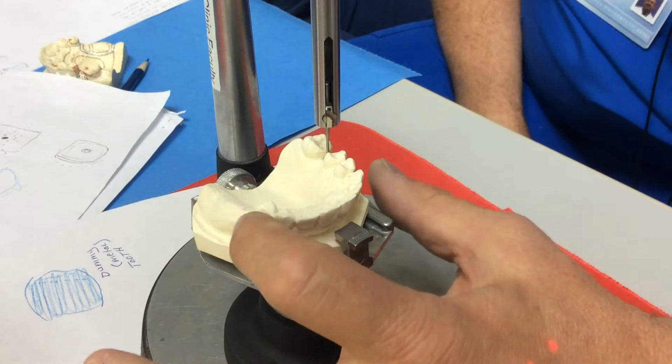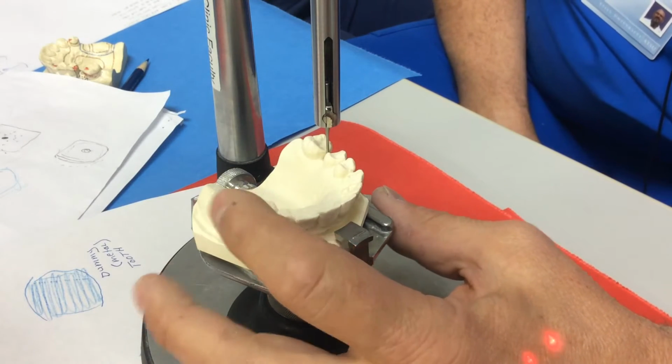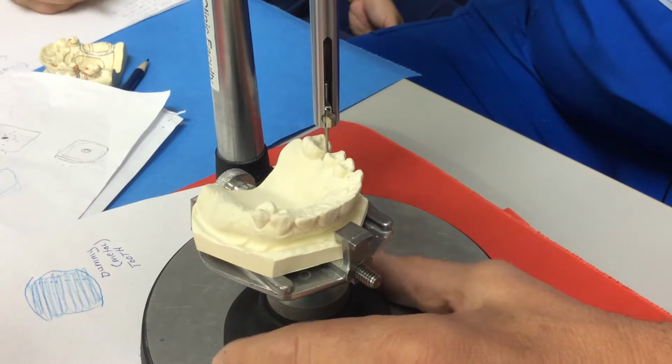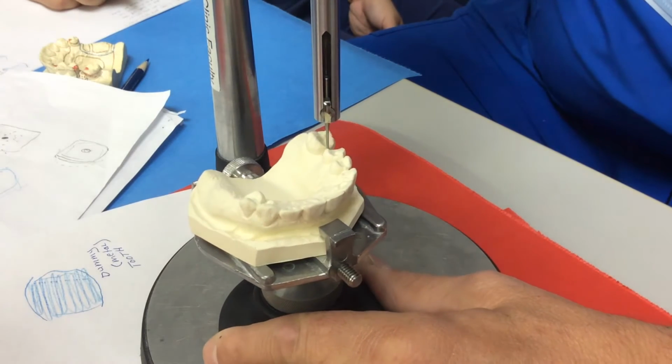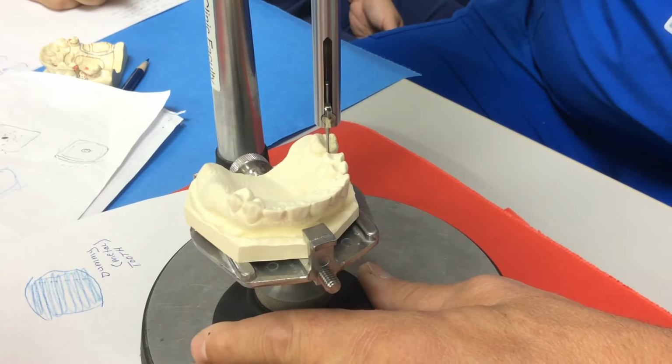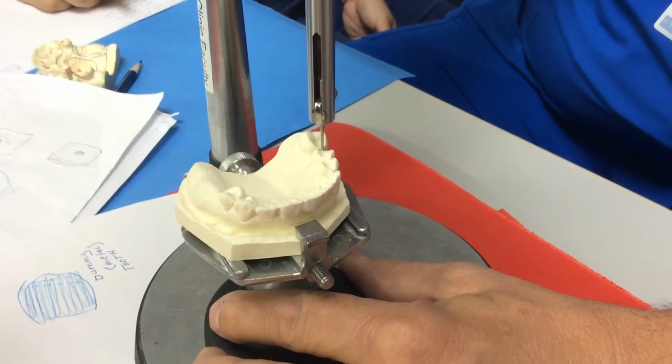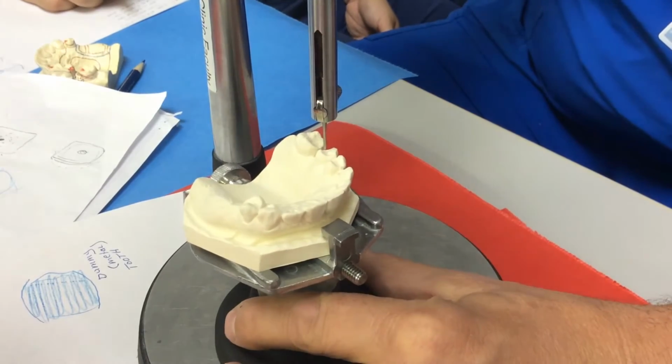When I look at the other premolar, no matter what tilt I have, I tend to be okay on the other premolar. So when I look here now, I still have some adjusting to do on the molar. Not too awful much though. And I would have to adjust a little bit on this premolar.